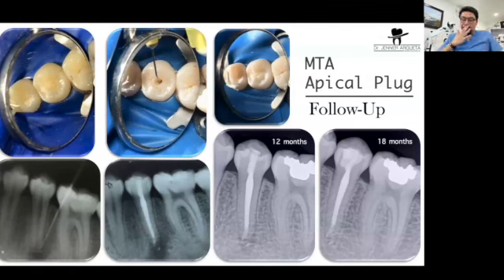Some people say, and this is important to analyze, because I have students, I have people that maybe I meet during my lectures, and they say, you know, Jenner, the microscope is nice, the microscope is good, but I have been practicing dentistry for 20 years, and I have good clinical results. If you only think about clinical results, maybe you will obtain good results, but you are not thinking about the health of the dental practitioner.